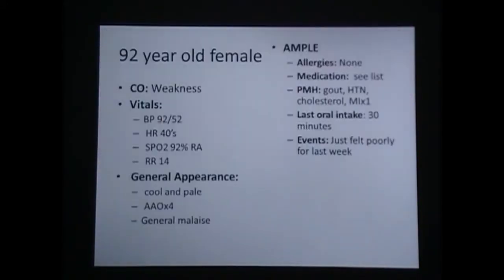And the clinical picture, when you go back: heart rate of 40, general malaise, blood pressure a little bit close to the crappy side.